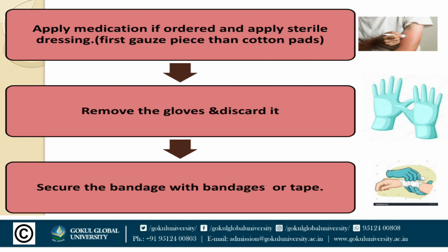These are the step-by-step procedures for wound dressing. Again I will repeat. First, give comfortable position. After that, hand washing. After that, wear gloves, gown and mask. After that, open the sterile tray, spread the towel around the patient, take the dissecting forceps, remove the old dressing, and place that dressing material in the paper bag.